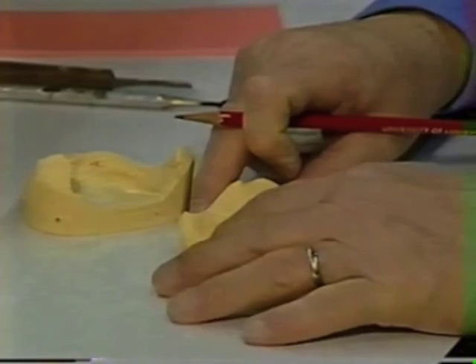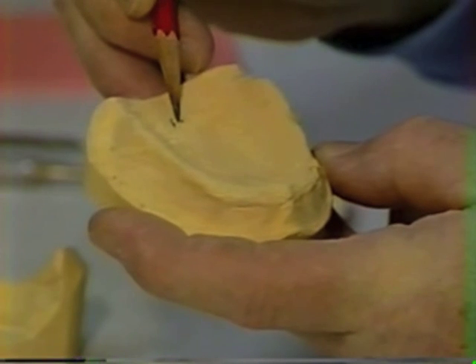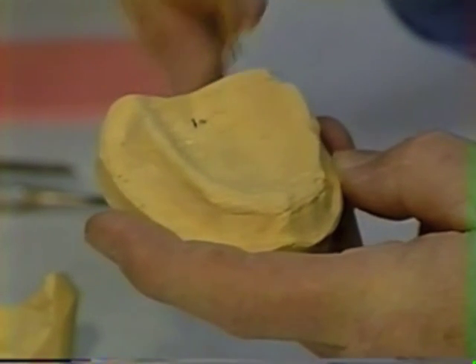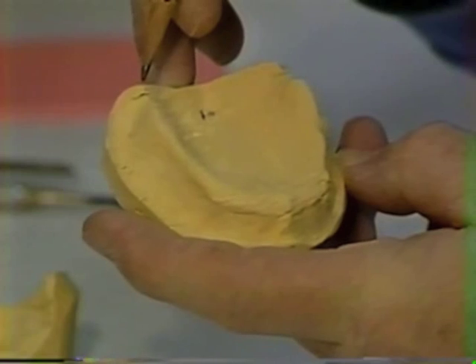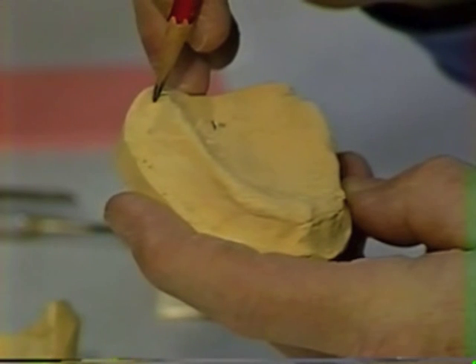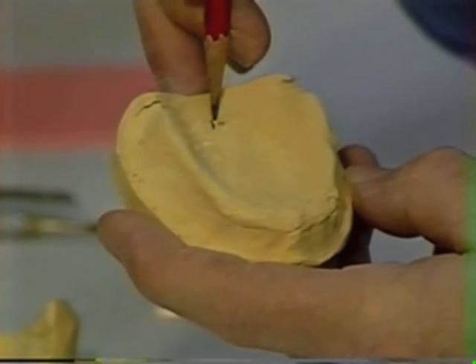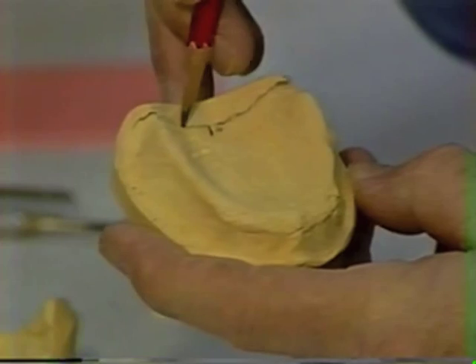I usually start by looking on the palate of the maxillary and looking for the fovea palatini. We see those right here, and I want to make sure that my tray is at least as long as the fovea palatini, and preferably just slightly longer. In addition, we want to look for the Hamular Notches, which generally are going to be right about here. We can see coming out of the back of this the pterygomandibular raphe, and we want to look for the Hamular Notch, which means that our tray wants to come through the Hamular Notch, and it's going to be about this length of the Hamular Notch on either side. Then we want it slightly longer than the fovea palatini, so we want that tray to come to about this area, just about there.